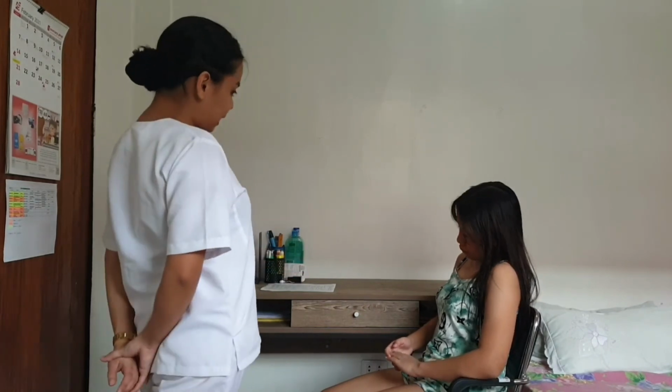Okay, so before I proceed, may I know if you ingested caffeine or smoked 30 minutes ago? No. Okay, I asked this because smoking constricts blood vessels and caffeine increases pulse. So both cause an increase in blood pressure temporarily. So I will now ask you to be in a sitting position. You are already in a sitting position, that is great.